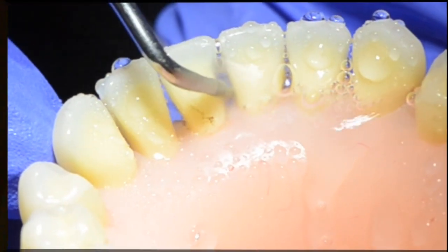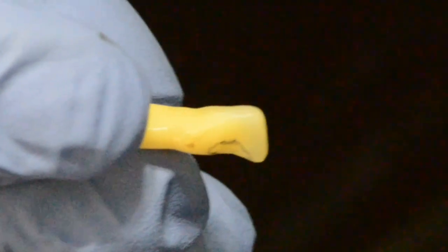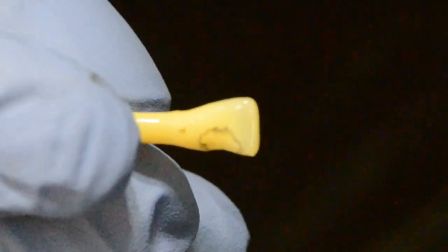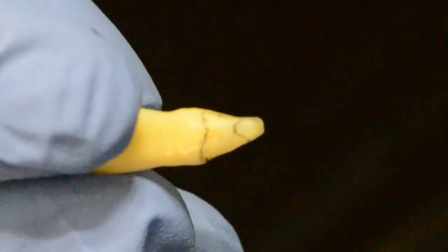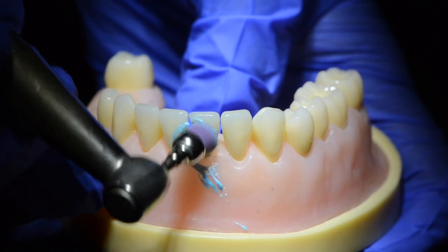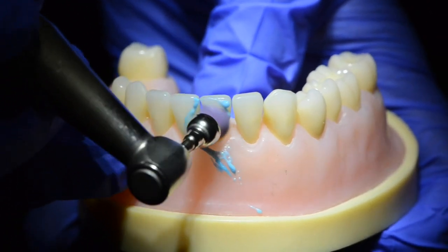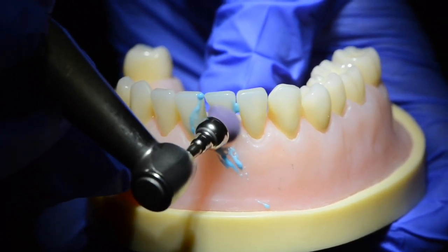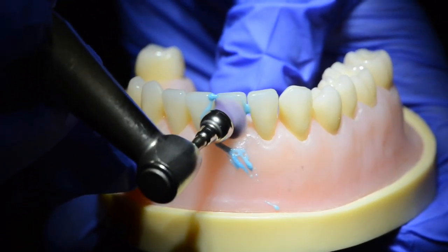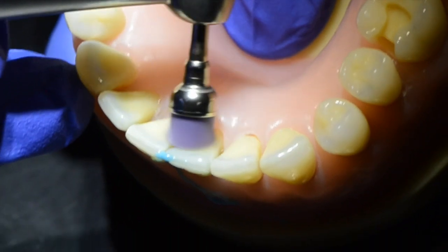Finally, I use pumice prophylactic paste with a rubber cup to get rid of any adherent biofilm. The feathered bevel is almost zero at the margin, promising you an infinity edge to your restoration. The key features of this type of preparation include a large surface bevel feathered down to near zero and the absence of sharp margins anywhere in the preparation.